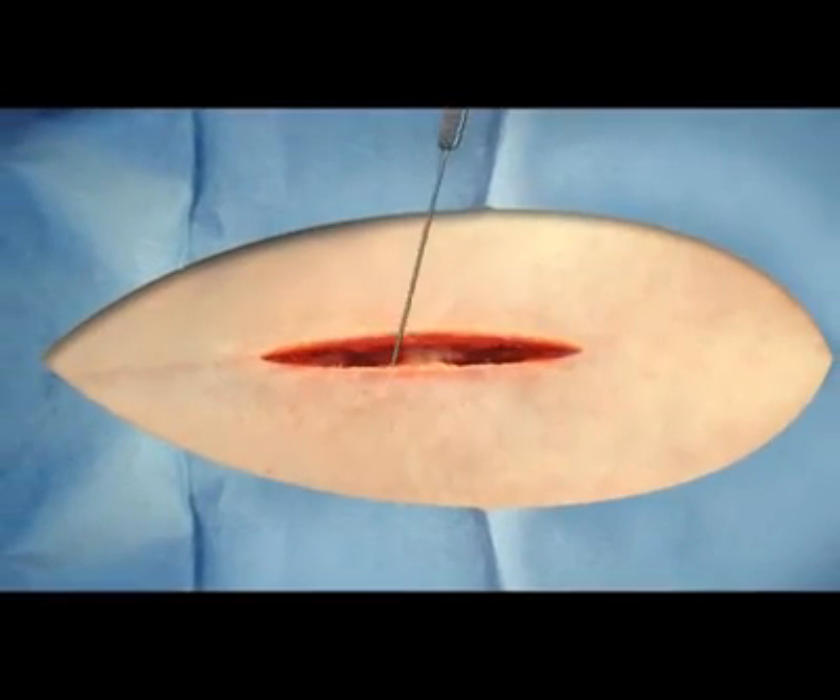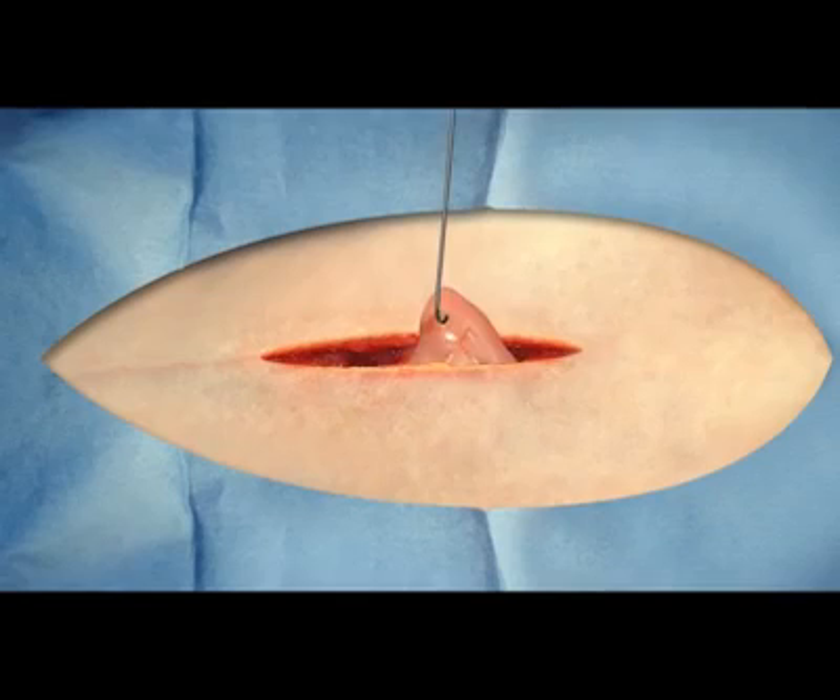Incisions through the skin and into the abdomen are made. A special instrument known as an ovariectomy hook is placed in the abdomen near the area of the left kidney.